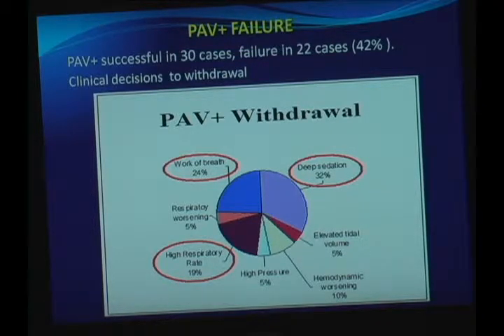You have to remember that we only had 4 hospitals participating in the study, because after asking everyone among our friends who is using proportional assist ventilation or not, who is confident enough to maintain patients in the middle of the night with it, only these 4 units accepted that they were almost prepared to do this kind of thing.